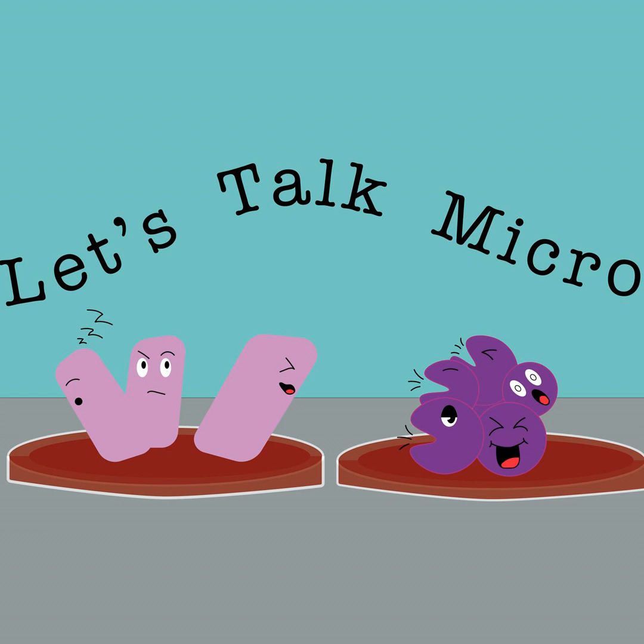Okay. And going back a little bit, I know that you talked about heteroresistance, and some techs, if you're listening, you have definitely experienced that. I've seen it, for example, on a wound culture, even in the same plate. You have two that look like Staph aureus, and you do your latex, and it's positive, but they look a little bit different, so you do the testing on both just to compare, and you do get those cases when one is MRSA and one is MSSA on the same plate.